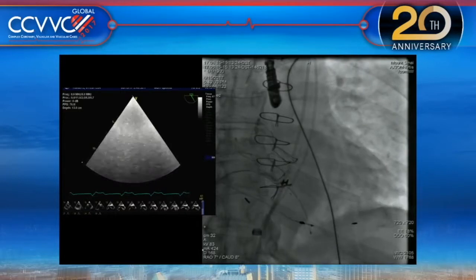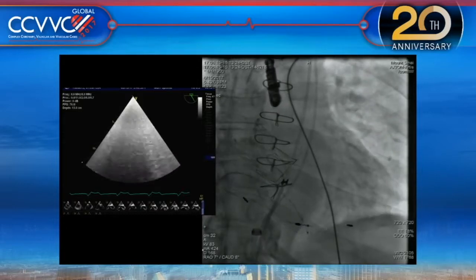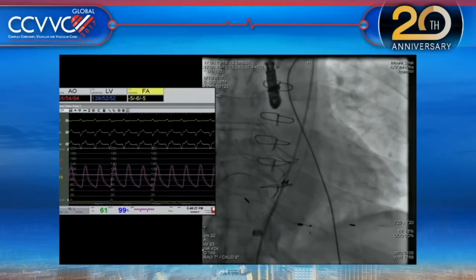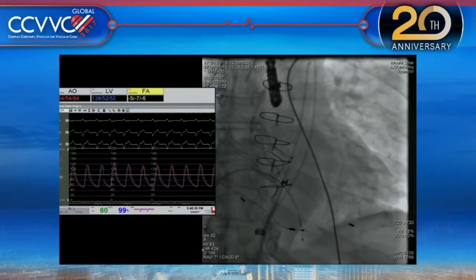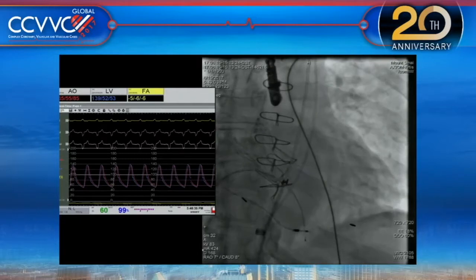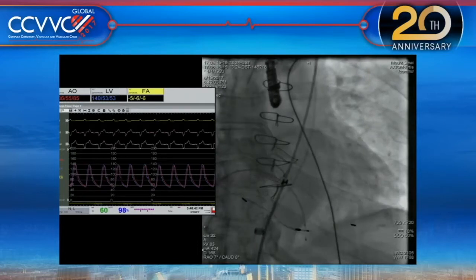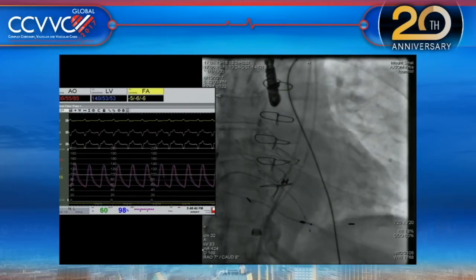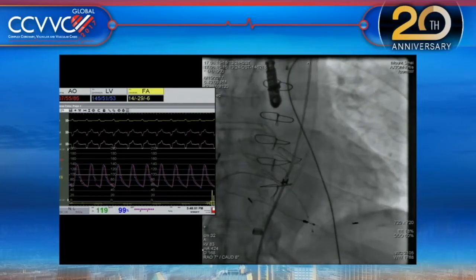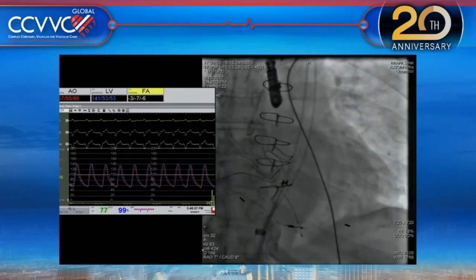I think the key here is the same with the bioprosthetic is that Evolute definitely is a better valve and as you see there, we barely get any gradient with this valve in valve. And I think positioning, which we showed you in that last slide, is key. When the valve is flaring up, you pace 150 or so and that's the time you release it fast. Very good result. Check it in a couple of views to make sure there's no parallax and that the valve is nicely placed around the ring, and once you're sure you just release it.